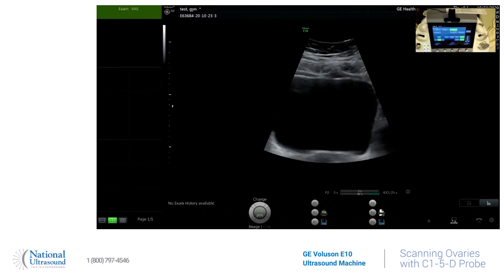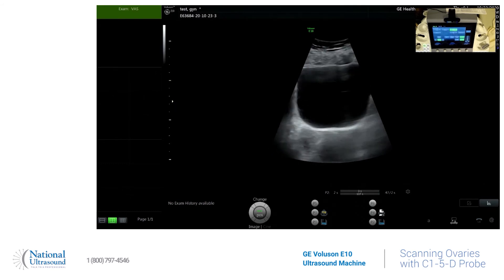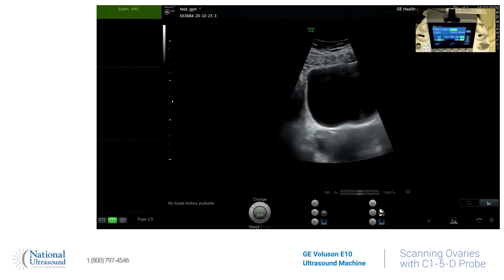Here is my overly filled bladder. You can see my right ovary right there. You can zoom in on your ovary — hit the depth and push down on that icon.